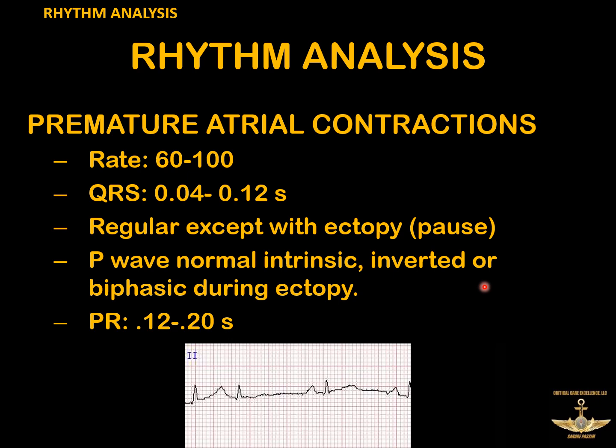These also require no treatment. What these are telling you, though, is that there's some irritable place inside the atria, maybe more than one, which maybe is not getting enough oxygen, or it has a little disease or something like that. And so these may be an early warning that somebody has some kind of conduction problem or ischemic problem, but it's not typically acute and doesn't require any treatment by itself.